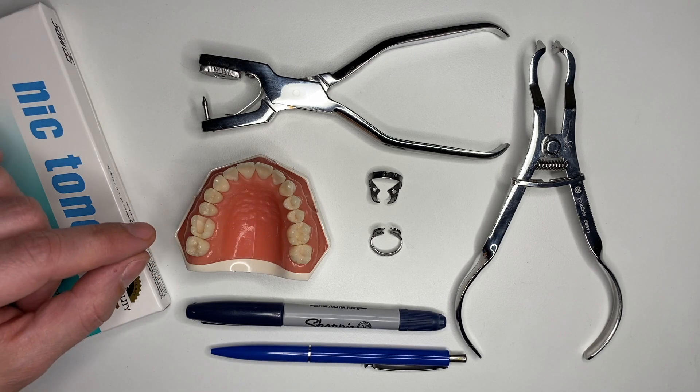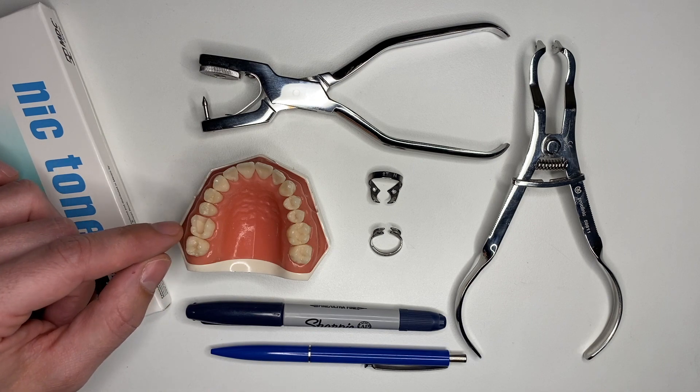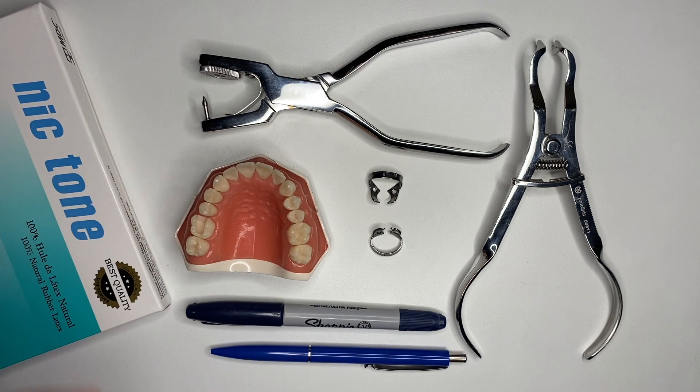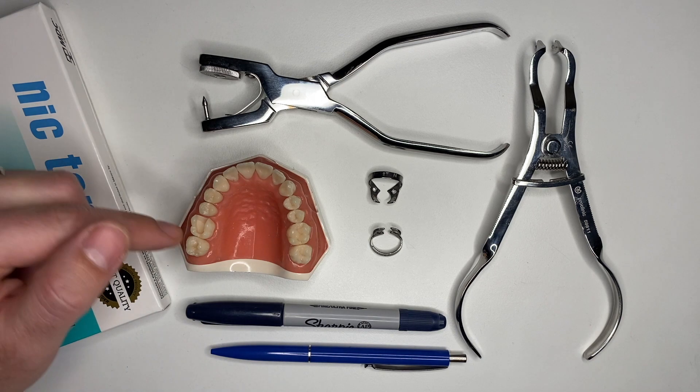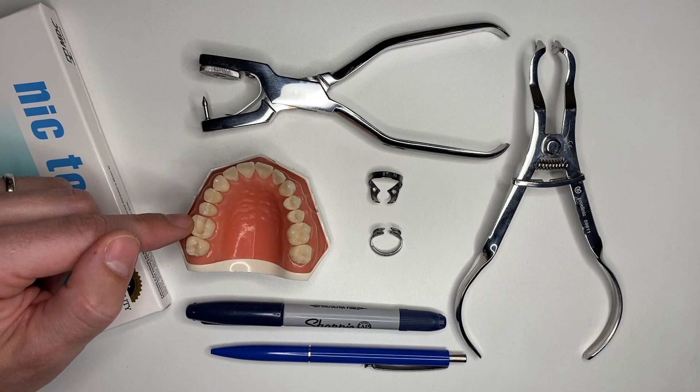We're going to pretend that this is an already instrumented tooth. This would be an actual situation if perhaps a broken fragment of the tooth was stuck between the first molar and the second premolar, and it wouldn't allow me to place the rubber dam first. Then I would have to make a cavity and then place the rubber dam.